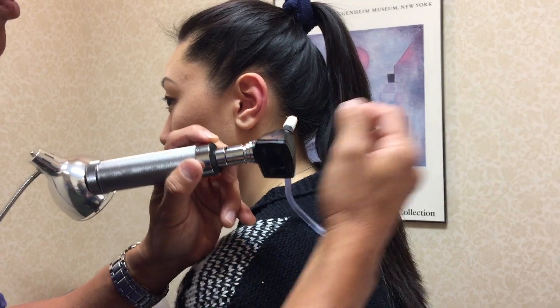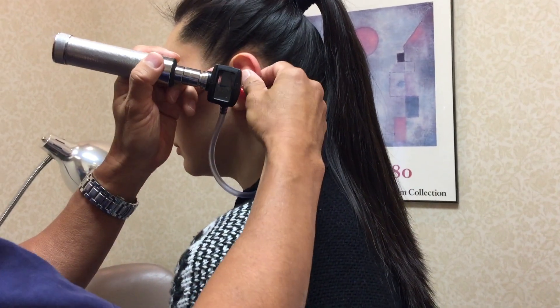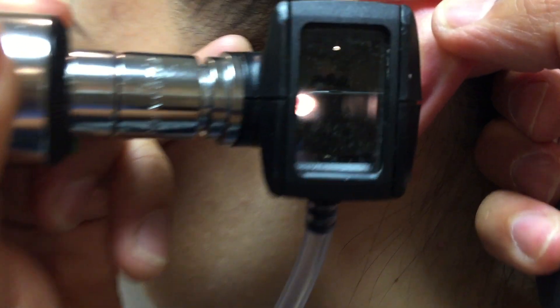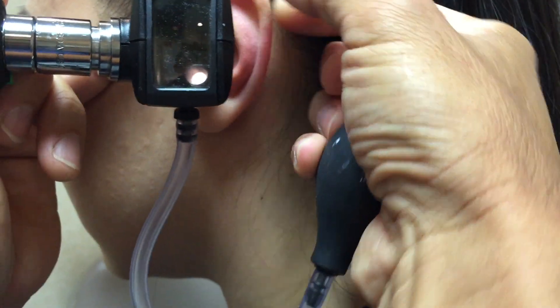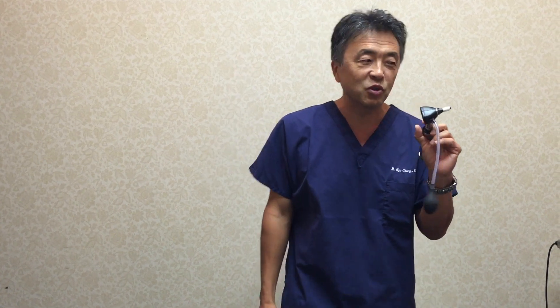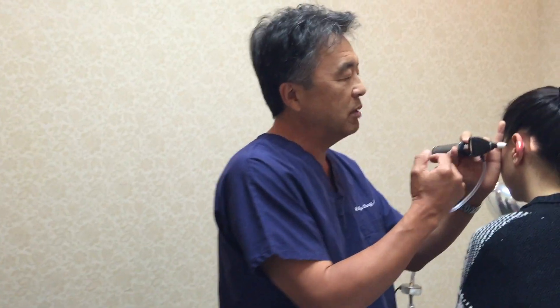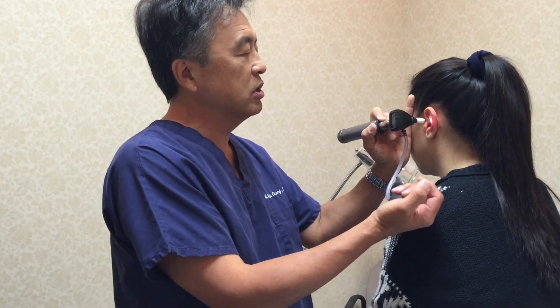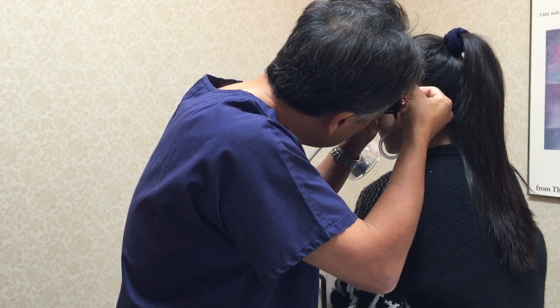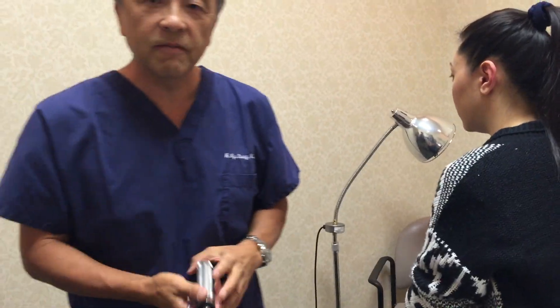I've seen people do this kind of action, but without a good seal it won't damage anything — it's just not very effective. So when you do this, you tug, and you just show the bulb here and do this kind of action. When you have this little action like that, the eardrum will flutter in reaction to it. I've tried to make a video of that with our iPhone, so you'll see that in a second. You just go like this — stabilize your instrument, pull back, and once you visualize the eardrum, it goes in and out very easily and it doesn't hurt.